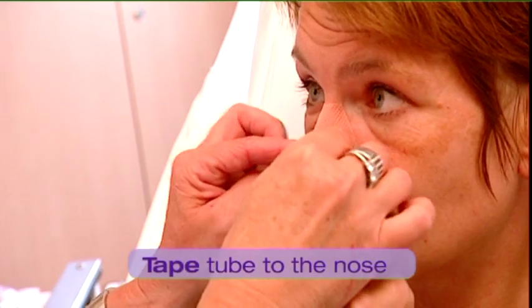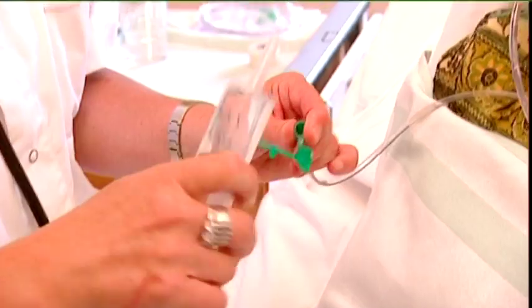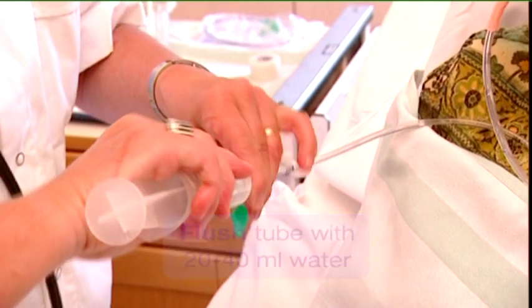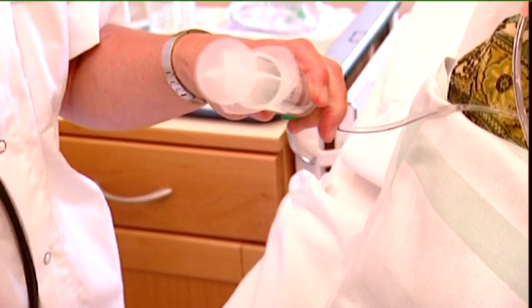Tape the tube to the nose, avoiding compression of the tube against the nostrils. After assessing that the tube's placement is correct, inject 20 to 40 milliliters of water into the tube. This will avoid acidification and coagulation of the tube feed and, as a consequence, will avoid obstruction of the tube.